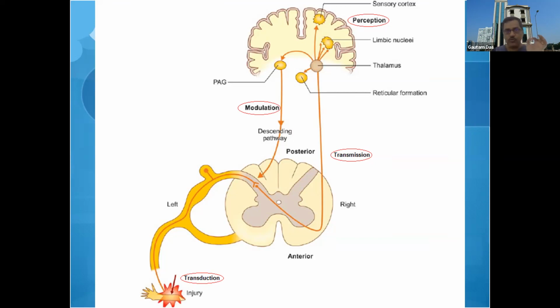So for motor fiber stimulation, we need a lesser Hertz. Most commonly we give 1 to 2 Hertz, but the range is 1 to 10 Hertz. Between these frequencies of alternating current, you can stimulate the motor fibers.